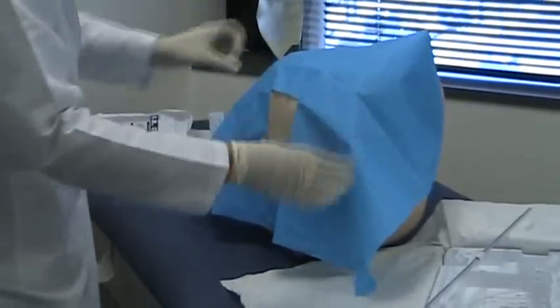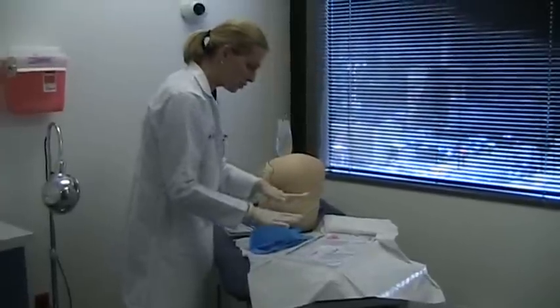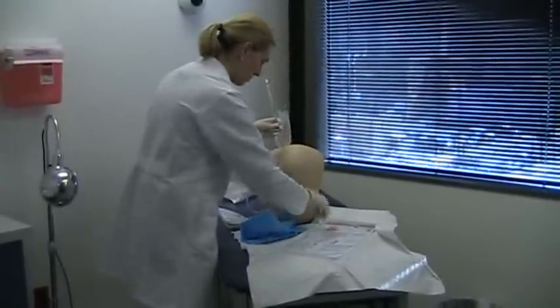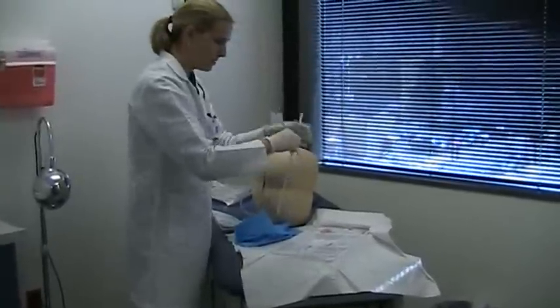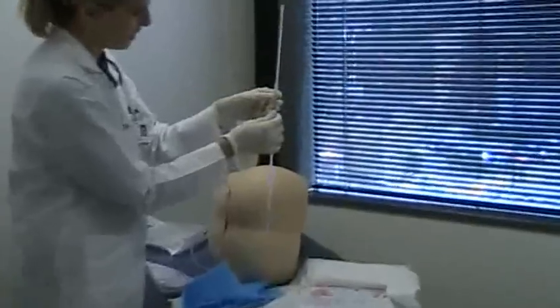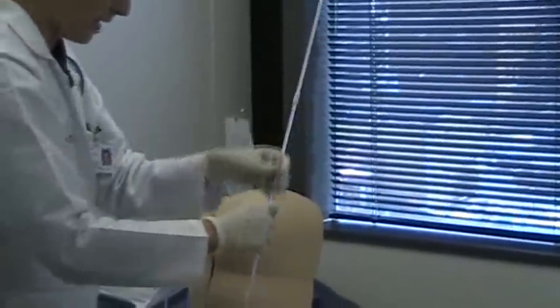Now we are ready. We use the fenestrated drape to ensure we have a good working space and area. Then we set up the manometer, making sure all the numbers are aligned. The last number on this manometer is 36, so we start at 39 — we never know how high the intracranial pressure or opening pressure will be.